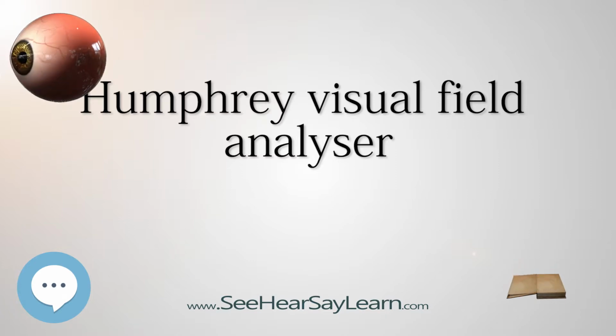Interpreting results. Reliability indices. Issues of reliability are critical in result interpretation. These include, but are not limited to, the patient losing concentration, closing their eyes or pressing the buzzer too frequently. Monitoring fixation is made visible via the display screen and gaze tracker, located at the bottom of the printout. The degree of reliability is determined by the reliability indices located on the printout, Fig. 4. These are assessed first and allow the examiner to determine if the end results are reliable.